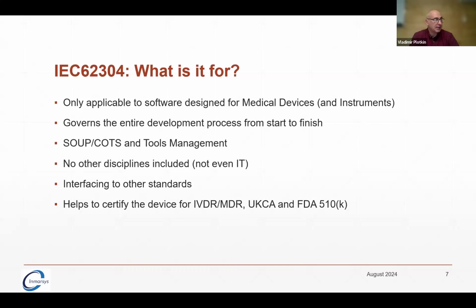If you're not familiar with these acronyms, at the end of the presentation there is a big table explaining what they are. But generally, SOUP is software of unknown provenance, and COTS is the same thing in FDA's lingo. It means commercial off the shelf. It doesn't really have to be commercial, but it's something acquired from a different source, or in engineering speak, not invented here. So it's not software being designed as part of this project. It could be well designed as part of some other department in the company, but not for this specific purpose.